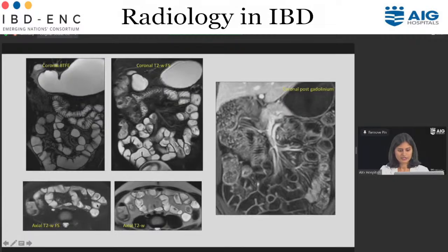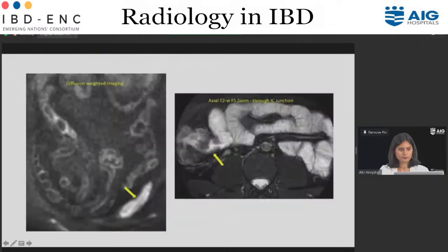These are the axial T2 weighted images. First is the fat suppressed and the second is the without fat suppression image, which are supposed to highlight bowel wall edema. The image to the right is a coronal post-contrast T1 weighted image, which shows uniform bowel wall thickness and enhancement throughout. Top left corner, you see a bunch of jejunal loops, and in the lower half of the abdomen, we see uniformly distended ileal loops with uniform wall thickening and enhancement.